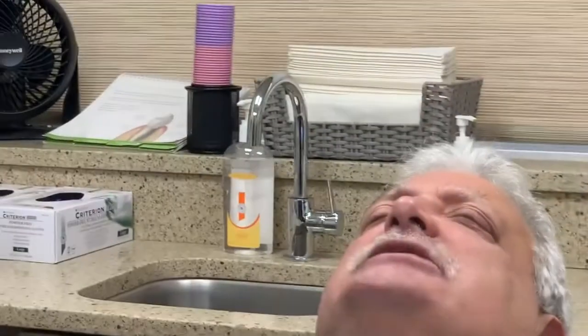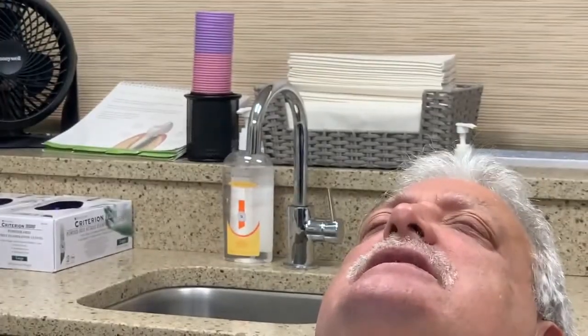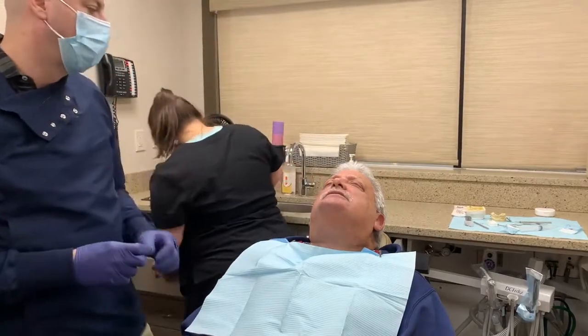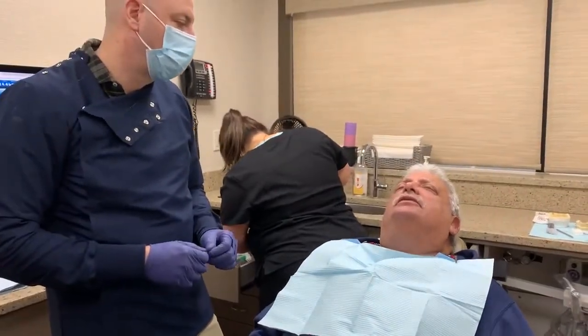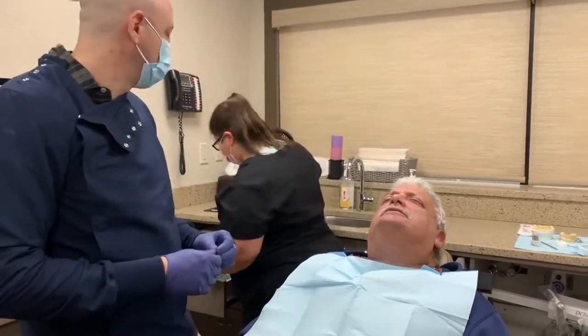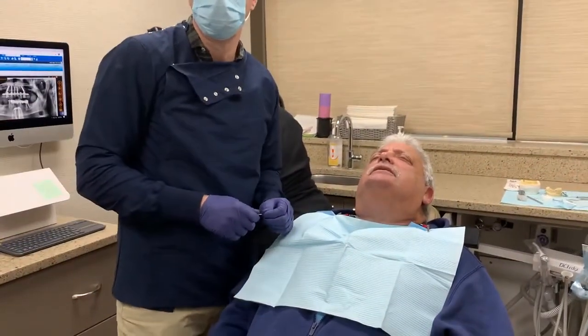Now I just want to confirm our occlusion. When you're biting down, do we have articulating paper? When you're biting down, does your bite feel even, or do you feel like you're hitting on one side more than another? Feels pretty even. It might be hitting a little on the left side. Okay. But it feels pretty even.